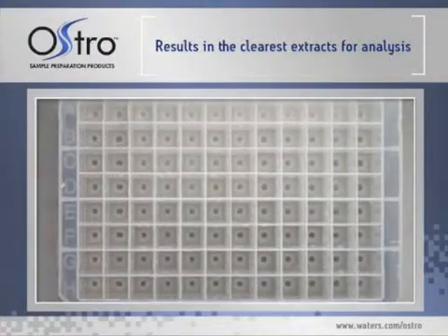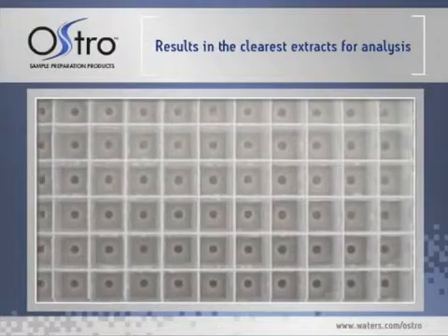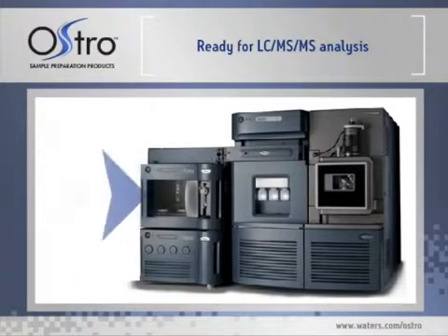Discard the Ostro plate. Remove the collection plate containing the clear filtrates and seal with a cap mat. The filtrates in the collection plate are now ready for LC-MS-MS analysis. They can be directly injected, diluted prior to injection, or evaporated and reconstituted with an appropriate solvent.